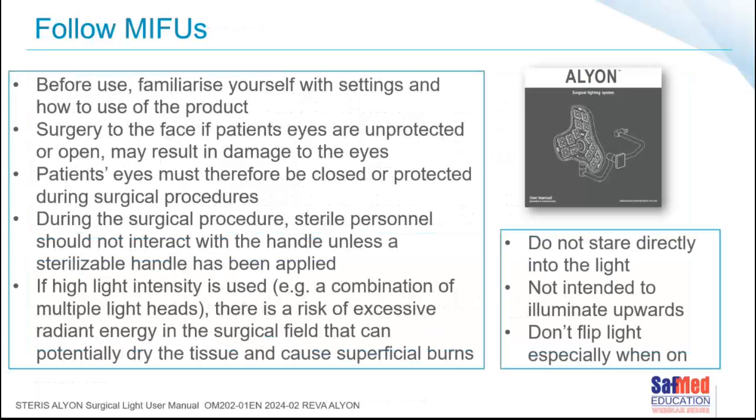So I'm going to use a few points out of this manufacturer's user manual as a guideline, as an example of things that we should think about when following the manufacturer's instructions for use. Because remember, in these incidents that we've seen, it wasn't the surgical light that was at fault, it was how we used it. I think we may have become a little bit lax because we've become very used to LEDs, and of course LEDs are really not as hot, and maybe for that reason we've become a little bit more lax. Always important, it'll say familiarize yourself with the settings and how to use the product before you use the product, so make sure you've had very good in-service training.